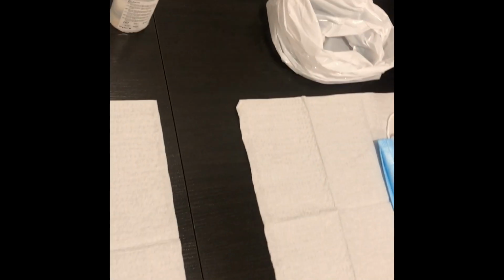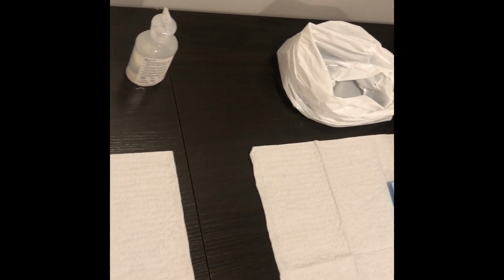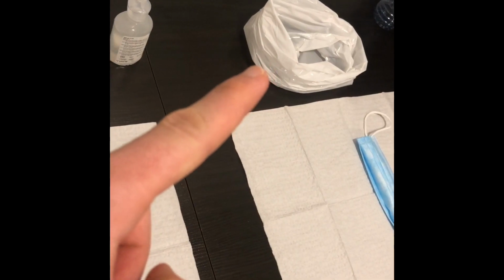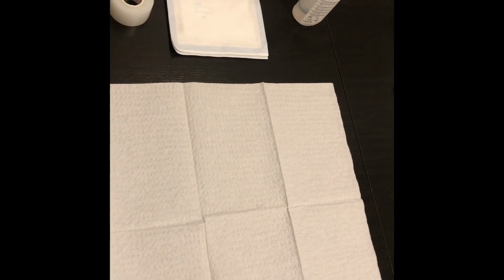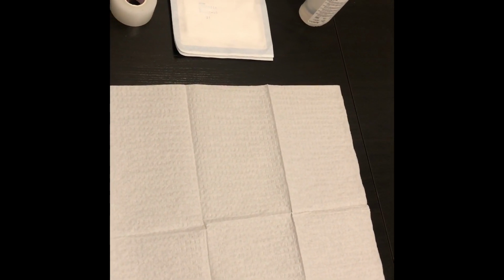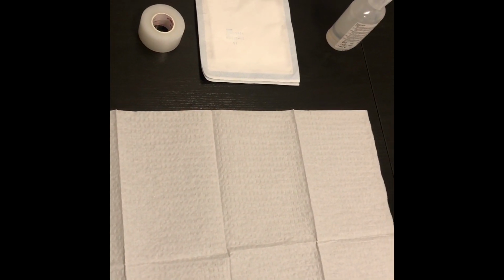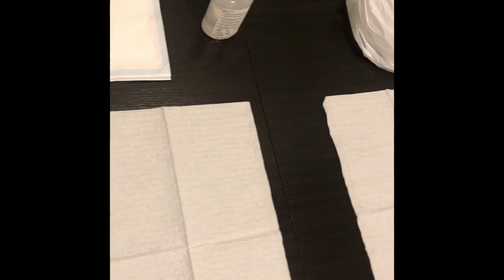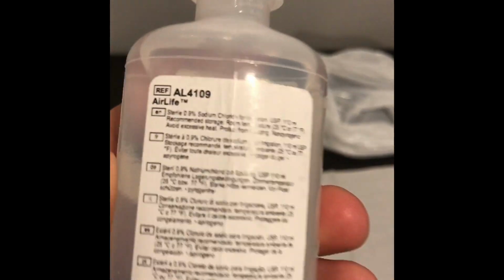The student removes garbage bag and puts it within reach of the work area between the client and sterile field. The student prepares the solution, normal saline, as needed, pours off into bag, performs second and third check of saline before and after solution is poured. Second check, pour off into garbage bag, and perform a third check.